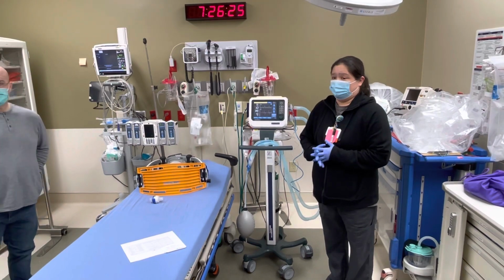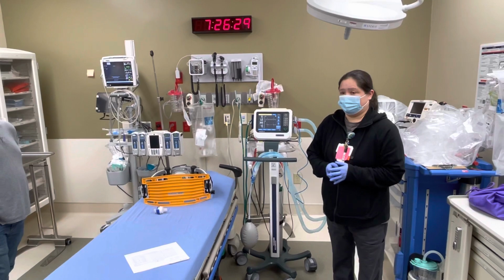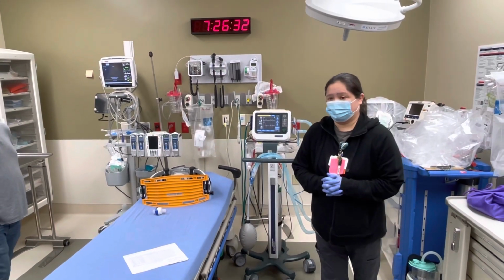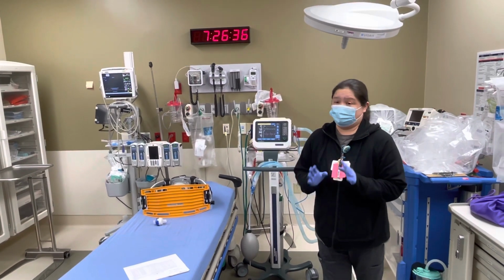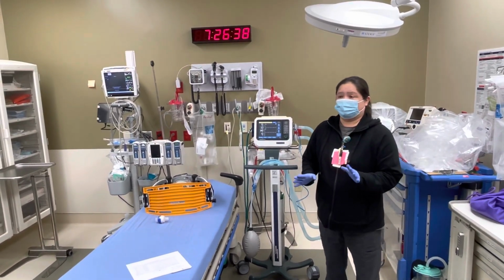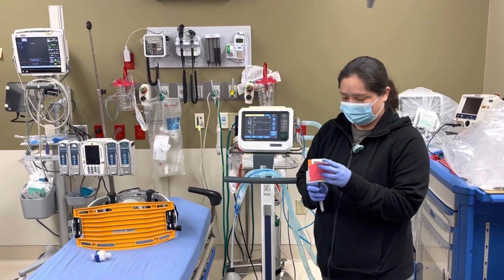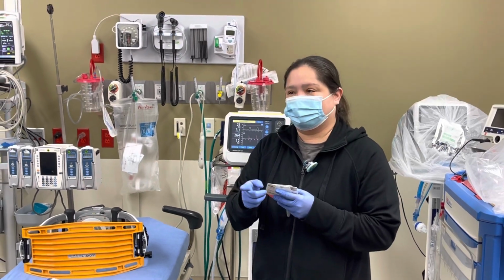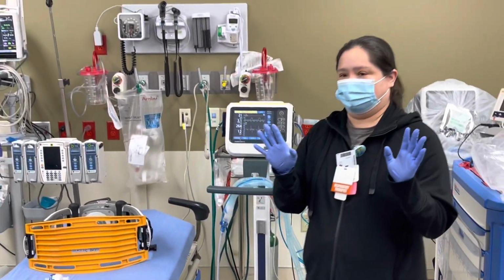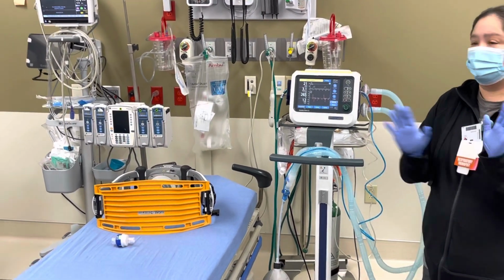So a while ago, you were messing with the settings and you said that sounds about right. Is there, for an average sized person, a specific setting that we could start them at? It's based on height. Really what you'll need is your ideal body weight, and your physician will give you the tidal volume and PEEP that they want. Our docs will typically say this tidal volume, this PEEP. Perfect, then they'll tell us that and we can just make our settings.